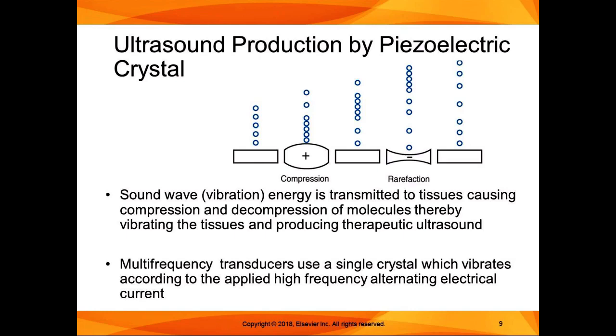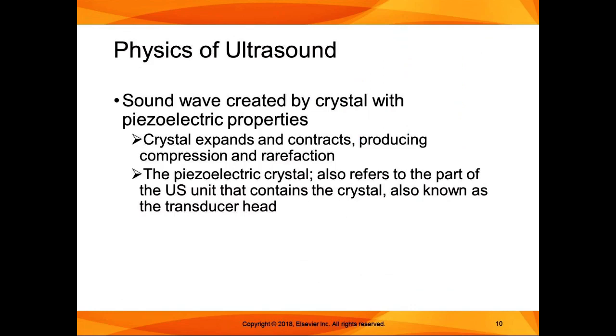That's all I'm going to say about that. So the sound wave that is created by the expanding and contracting crystal is what produces the wave. The piezoelectric crystal itself is also known as the transducer head. So it's the part of the ultrasound unit that contains the crystal. That's why you don't want to drop the ultrasound, because you can damage the crystal.